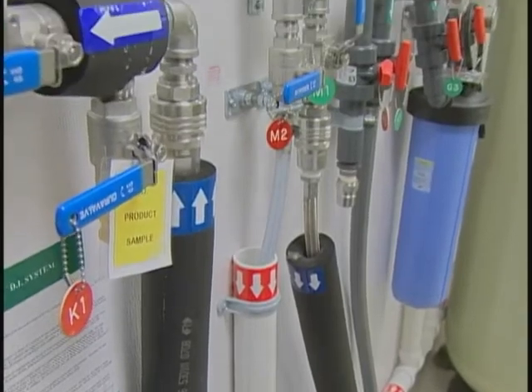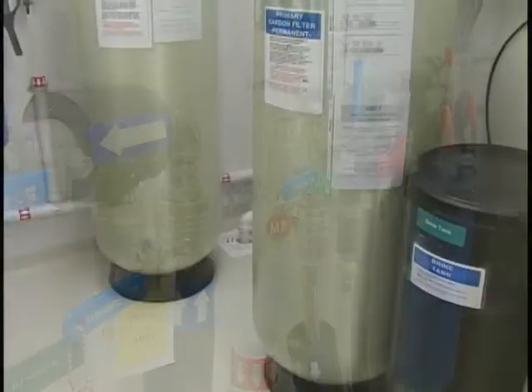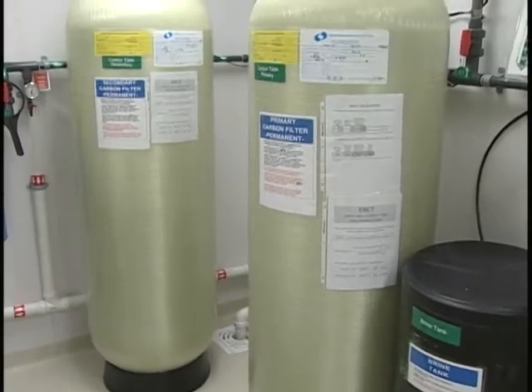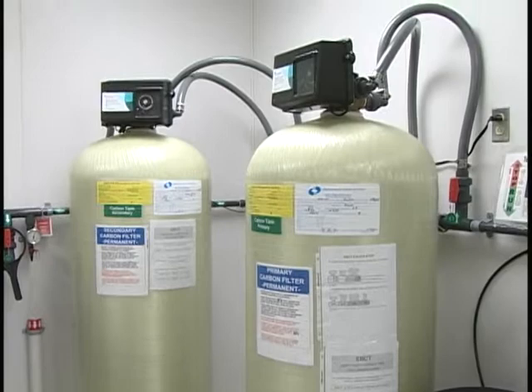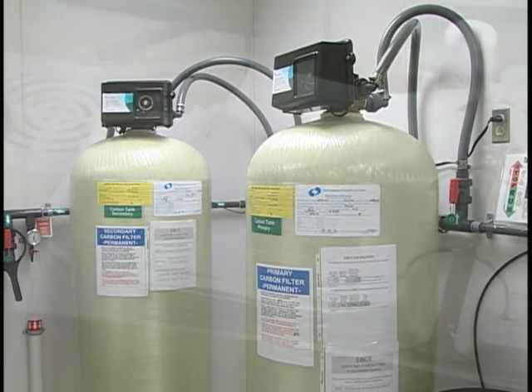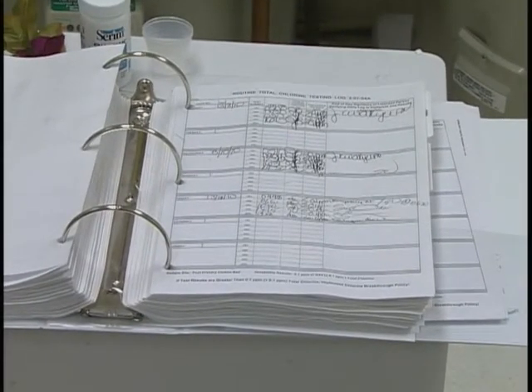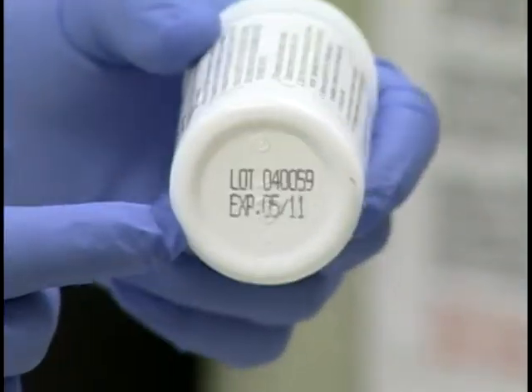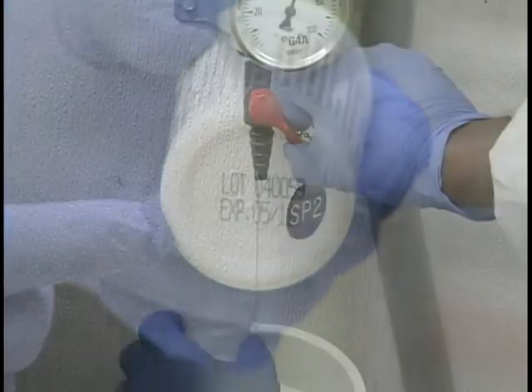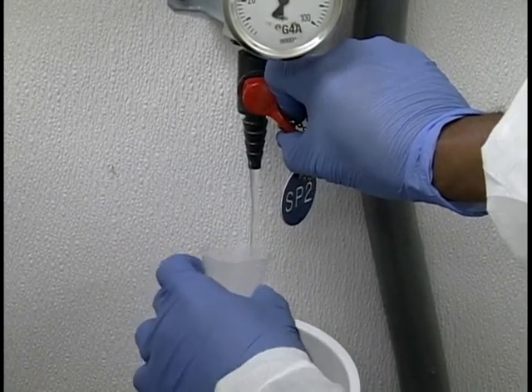In addition to posting signs warning that access to the water treatment room is restricted and identifying the system components, your survey observation must verify that there are 2 carbon tanks and document that the chlorine-chloramine tests are being performed prior to each patient shift or every 4 hours, and that the reagents used to test the water have not expired, and that the test methods in use are appropriate for testing purified water.